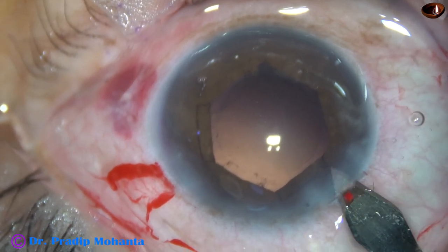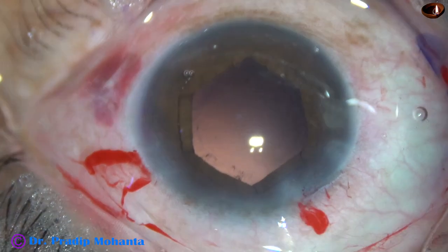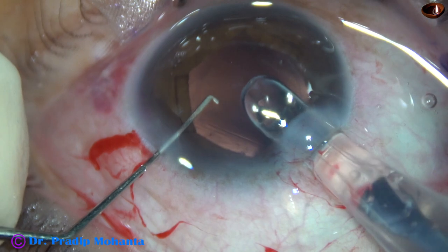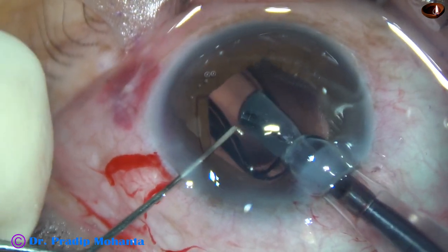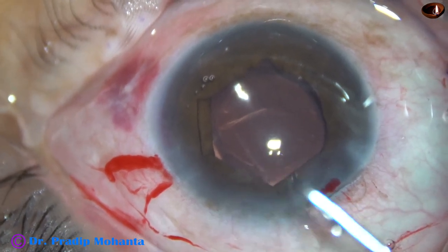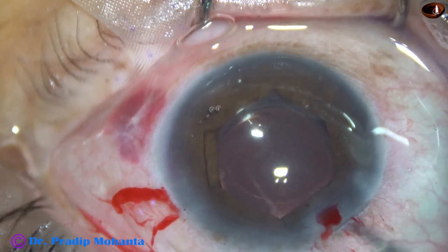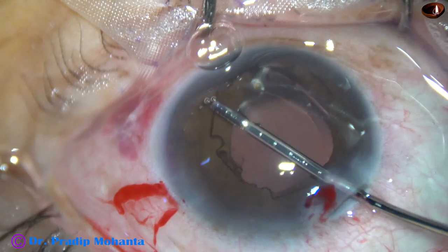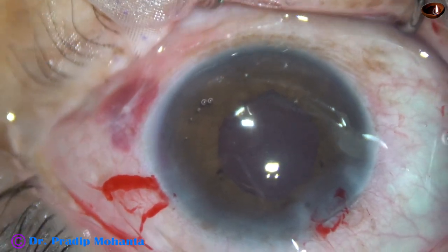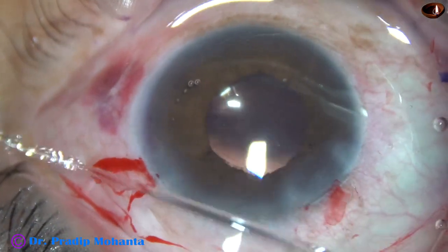Visco has been injected into the anterior chamber. Always enlarge the main wound a little bit when you have B-hex in the anterior chamber, because you go into the anterior chamber and deliver the lens in the capsular bag like this. The leading haptic should go into the capsular bag and the trailing haptic should be delivered in front of the B-hex ring so that the B-hex ring is not depressed by the haptic. And now the B-hex is removed — the flanges are untucked and the B-hex is pulled out. And now is the time to remove all the visco that is there in the anterior chamber and in the capsular bag.